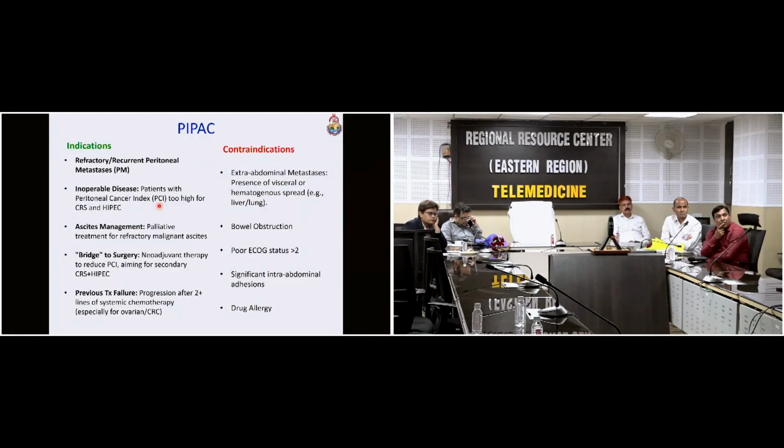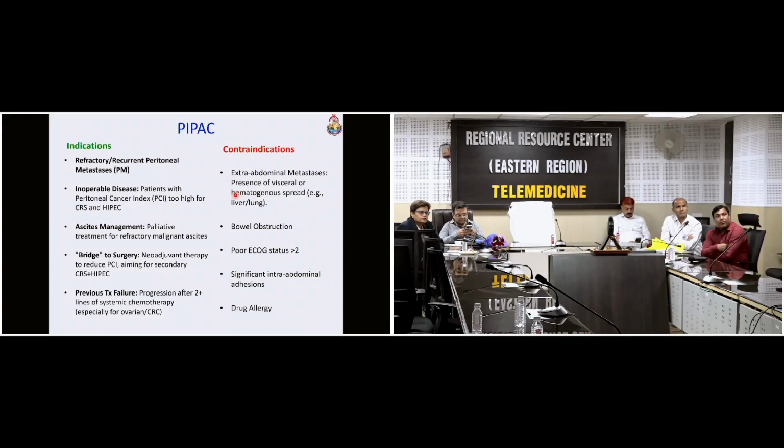So there are certain contraindications that we must know before we know about indications. If there is florid extra-abdominal metastasis, the ECOG status is extremely poor, the patient is in bowel obstruction, or there are significant intra-abdominal adhesions or disease so that effective pneumoperitoneum is not established, these patients are not candidates for PIPAC. And again, it's the standard that if any patient has any allergy to any of the chemotherapeutic drugs, definitely you cannot go ahead with it.